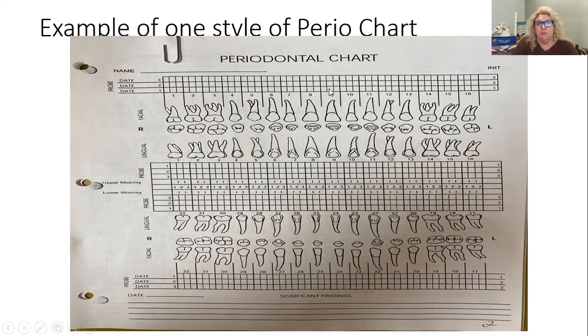Don't forget when we change over the midline that we have mesial, middle, distal. So don't forget that when we change over the midline for the maxillary and mandibular, where's that midline? We're going to change over. Okay. So just be aware. I know it's a little confusing, but it'll make sense when we start to chart.